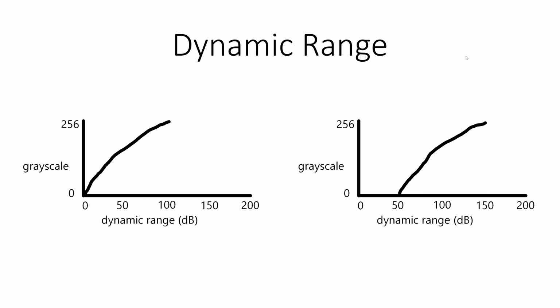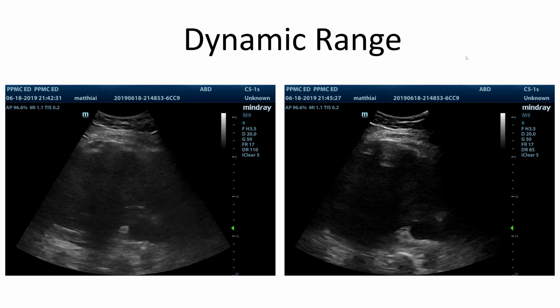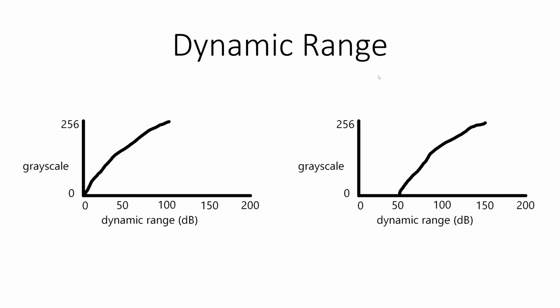That's an interesting case, but one that comes up not so often. I mean, we have enough patients with challenging body habitus that it's a good knobology skill to have, but it's really only less than half of the story of dynamic range.